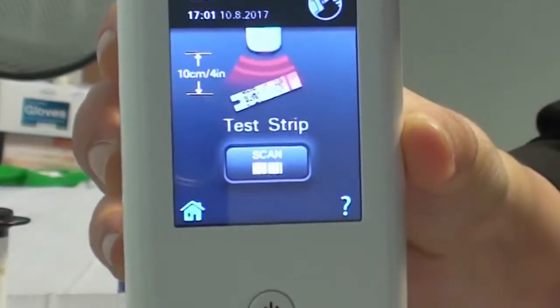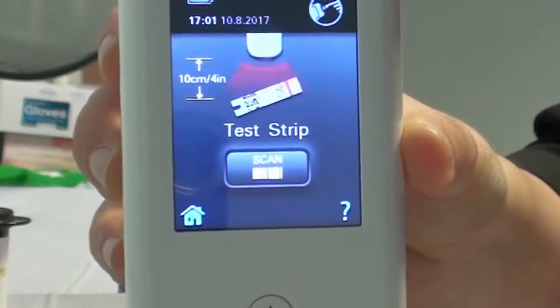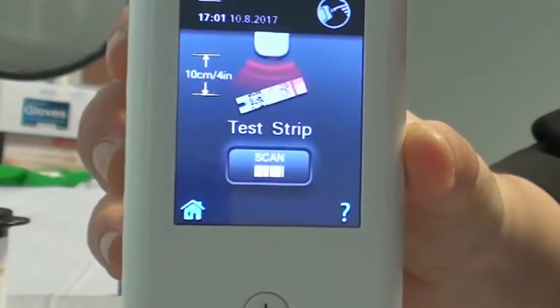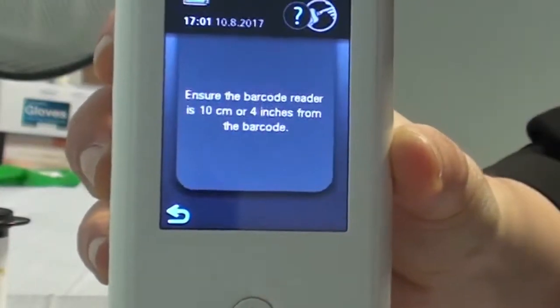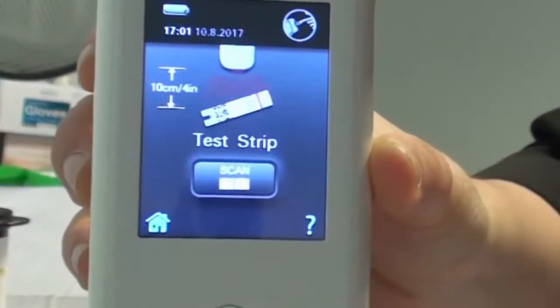The machine is now asking us to scan the strip, and if at any point we don't understand what the machine is asking us to do, you just click on this question mark here and it will give you an explanation. Press on that to go back.